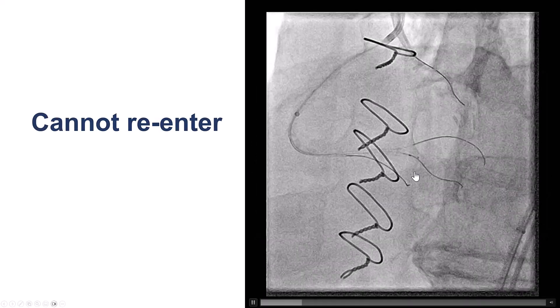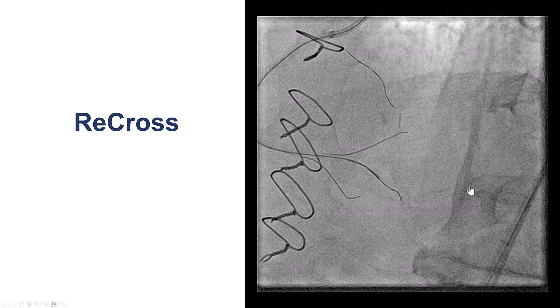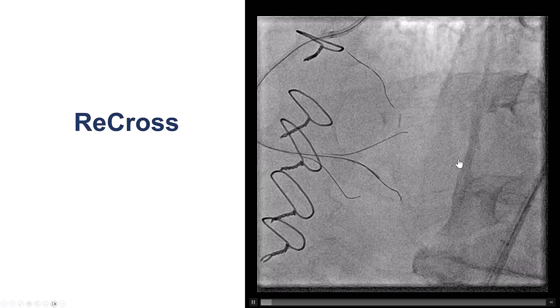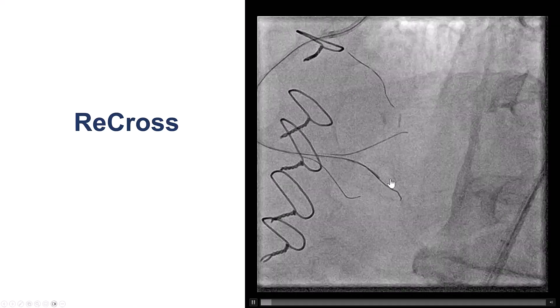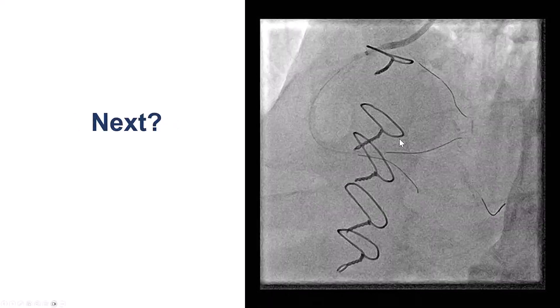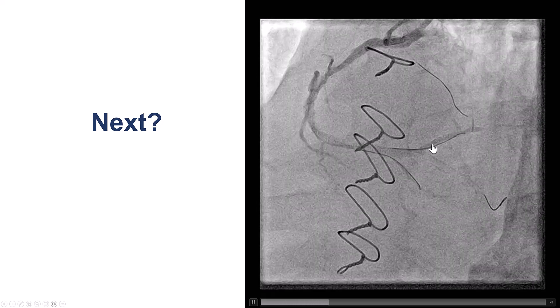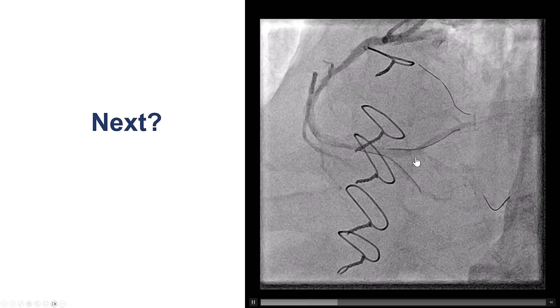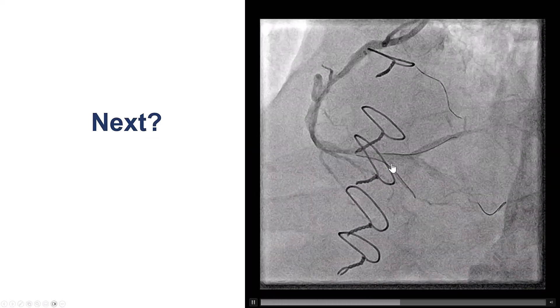We delivered a stingray and did multiple attempts to re-enter with double-blind stick and swap. Unfortunately we were not able to get into the vessel, possibly because of calcification — the stingray would not go any further. We used a Recross dual-lumen microcatheter and tried to re-enter using the Recross, but had the same issue. We were now seeing some hematoma and compression of the true lumen. We did some balloon angioplasty and saw good flow all the way to the posterolateral, but the PDA did not have very good flow. At this point, after a long time with significant contrast and radiation, we decided to stop.